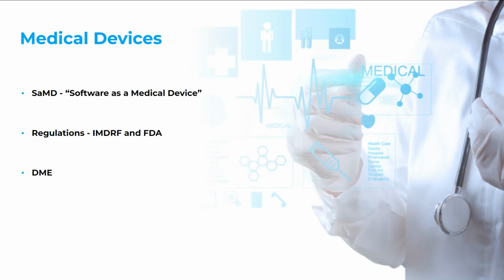If you look at what the FDA says, their definition is software intended to be used for one or more medical purposes that perform these purposes without being part of a hardware medical device. So it's something that does a medical purpose, one or more, but it's not part of the hardware medical device.